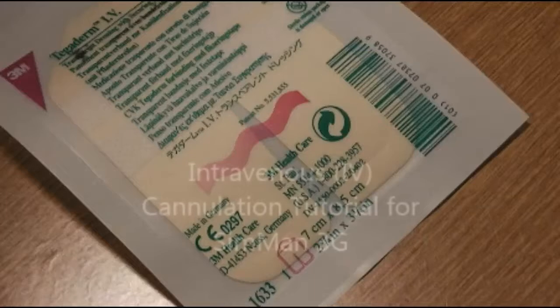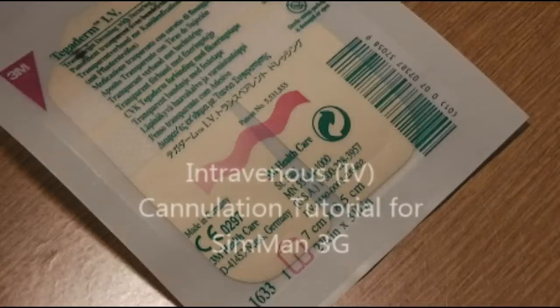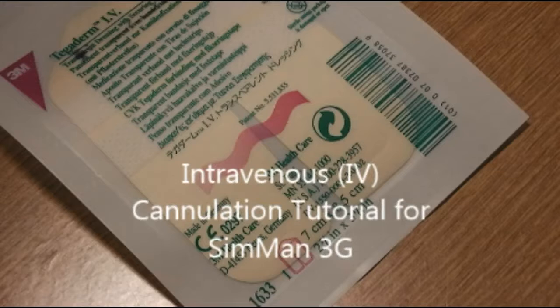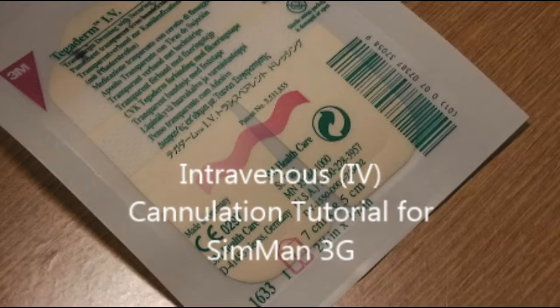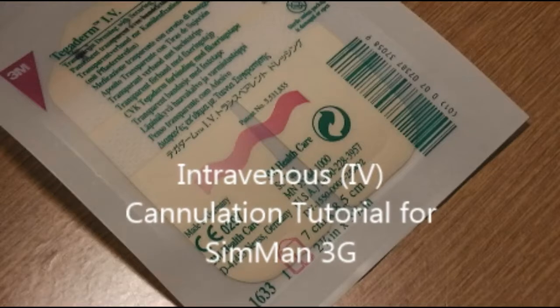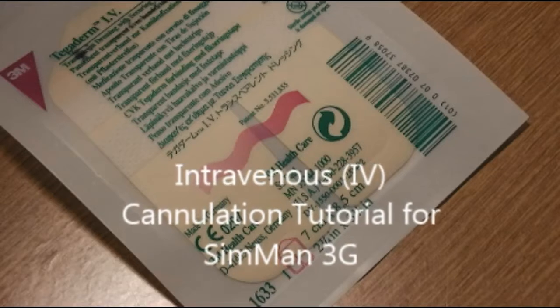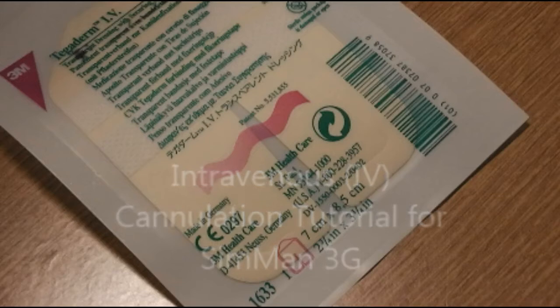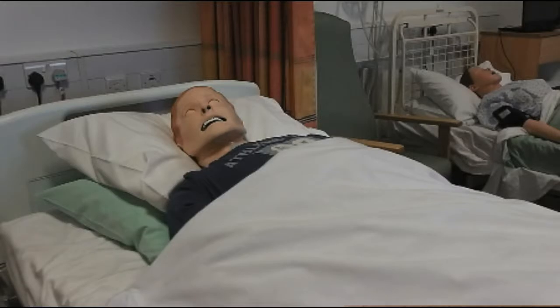Welcome to the intravenous cannulation tutorial for the SinMan3G. Insertion of an IV cannula involves putting a tube into a patient's vein so that infusions can be inserted directly into the patient's bloodstream. The same is true for the SinMan3G, which is a human patient simulator mannequin.